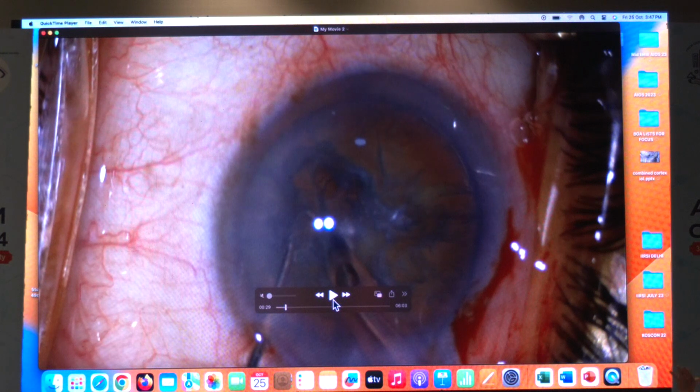Before that, I did not know of the PC tear. So why? Two things. One is, I have not noticed there was a PC tear. Secondly, vitreous has not come because there is a small PC tear. Thirdly, the PC has not gone behind, or if it has gone, I have not seen. Fourthly, when I was doing this, I have not seen properly.